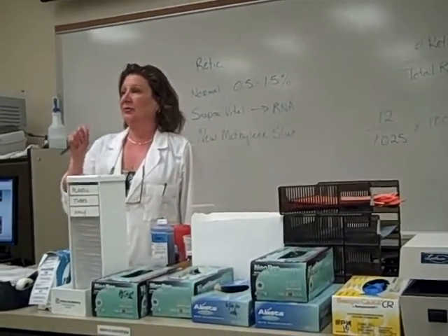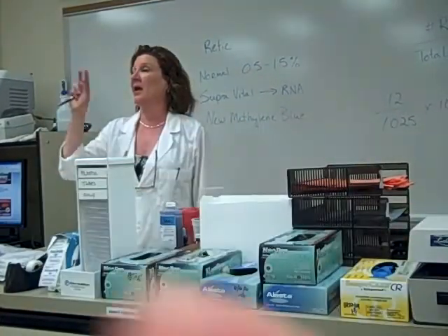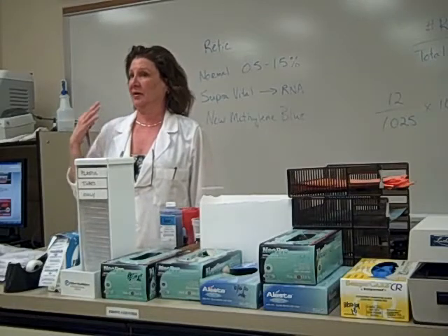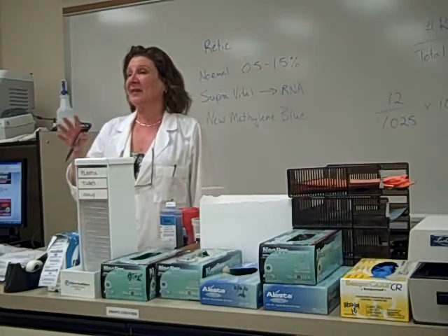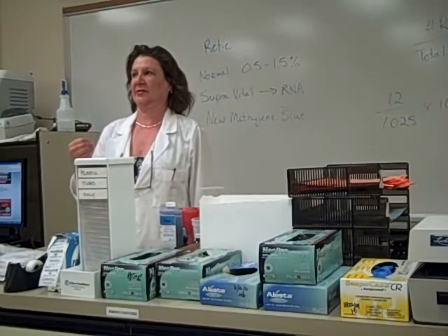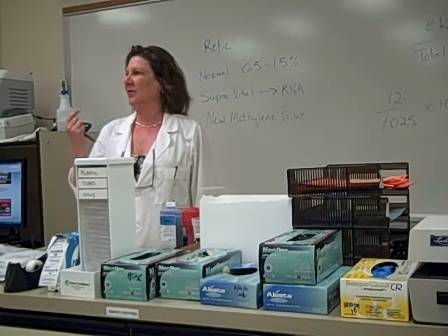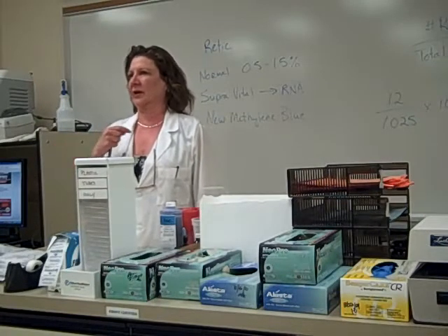But when you look at them today, I want you to do 2 today. Raise your hand when you think you found a retic, so we're sure you're counting the right thing. There's some artifactual elements that you might think are retics, so I just want to make sure you're actually counting the correct thing. If it's shiny or metallic or refractile, it's not a retic. So don't count it as that.